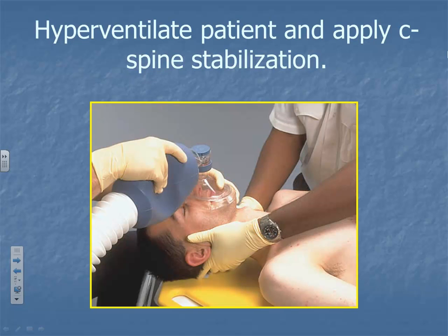You need to make sure that someone is securing spinal immobilization. Somebody's holding that. Whether you've got the C-collar on or not, you want somebody to secure that. Then you want to make sure you pre-oxygenate the patient while they're doing that. If you can't ventilate them while they're holding C-spine, you may have to tip the head back a little bit. You do not want air where?